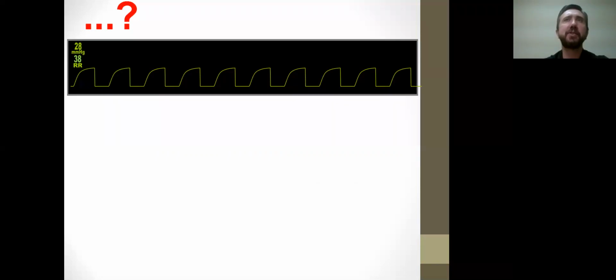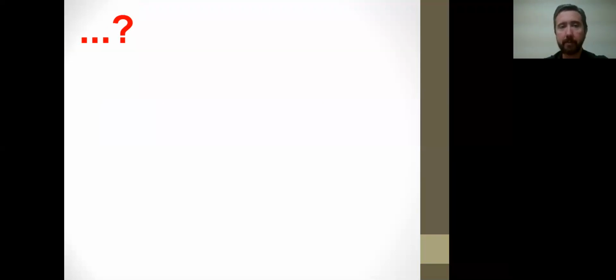All right, so just as an EKG is a window to the patient's cardiac status, this was the point that I was driving home: capnography is the window to the patient's ventilatory status and can go much deeper. Here in the specific situation, when we saw the VTach in the other patient and those critical vital signs, we see a shark fin type of appearance in a waveform on capnography, which should give us that same uh-oh factor and sense of urgency.